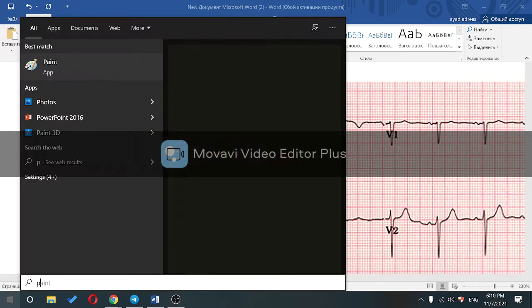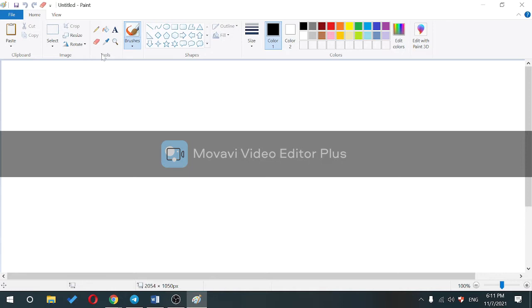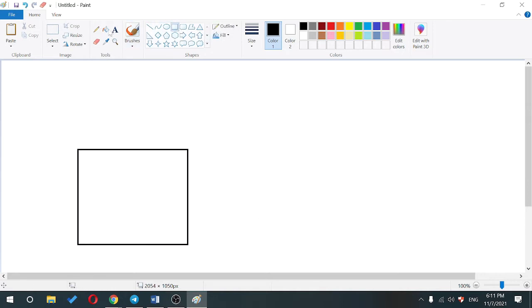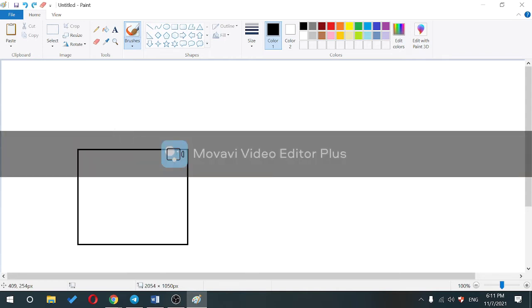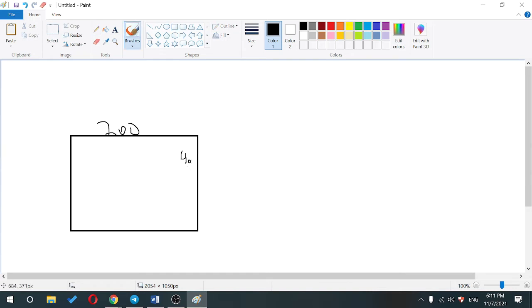Why? Because one big box is 200 milliseconds. So if I'm telling you that one big box is 200, one small box inside of it is like 40. I'm sorry, this big box is 200, and one small box inside of it will be 40. So you tell me, guys, how many small boxes can I fit inside of a big box?